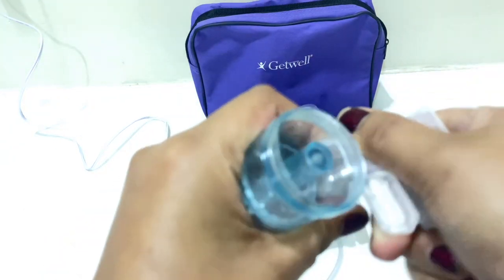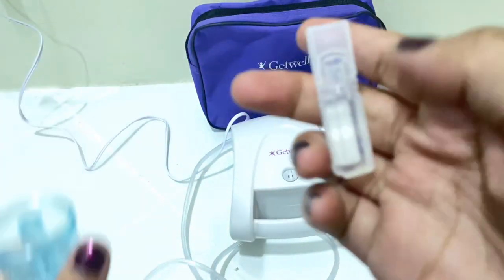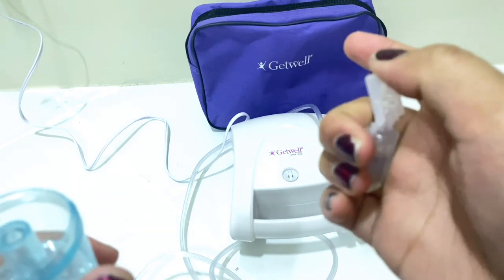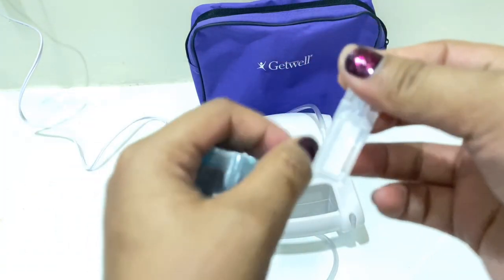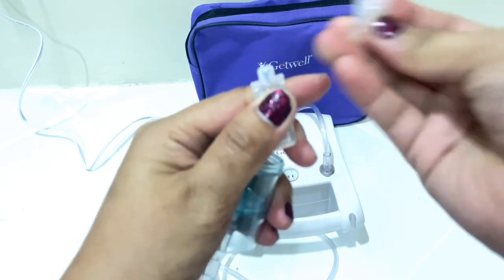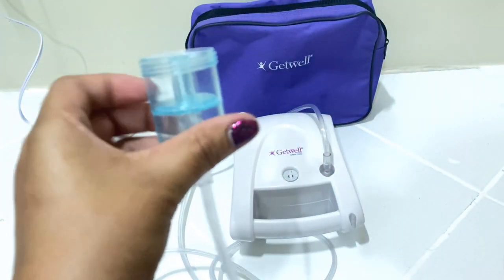So you have just to rip it. And then, how to open this medication is you just have to bend the upper part. Ganyan, i-bend mo lang siya. And then, after bending, you twist it. Twist. And, yan. Bend and twist lang. And then, ready na siya ilagay sa medicine cup.